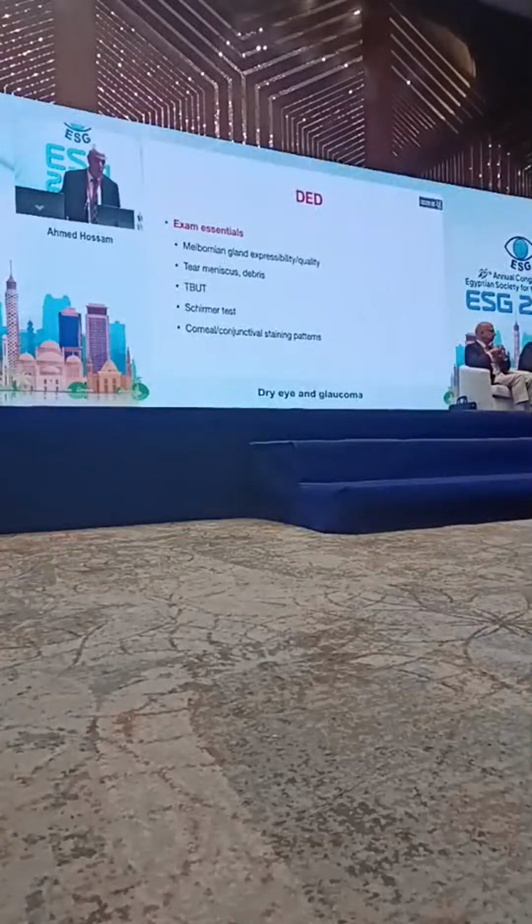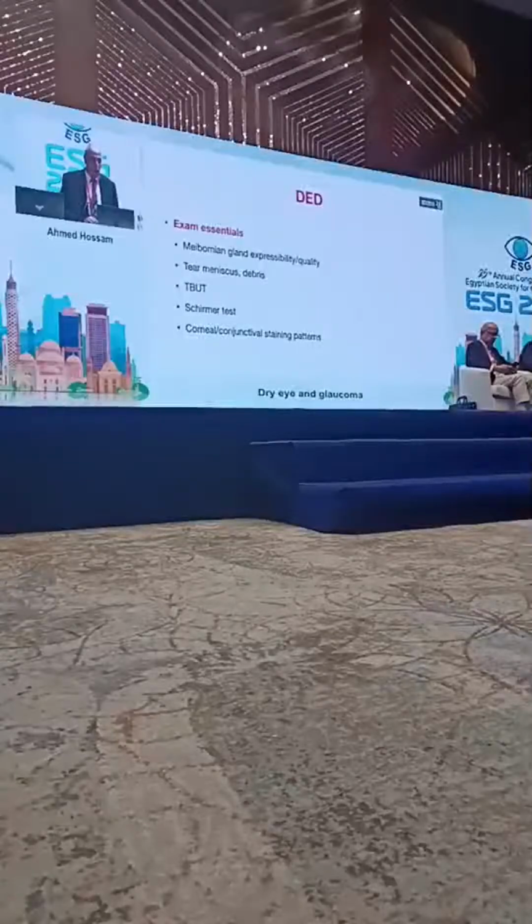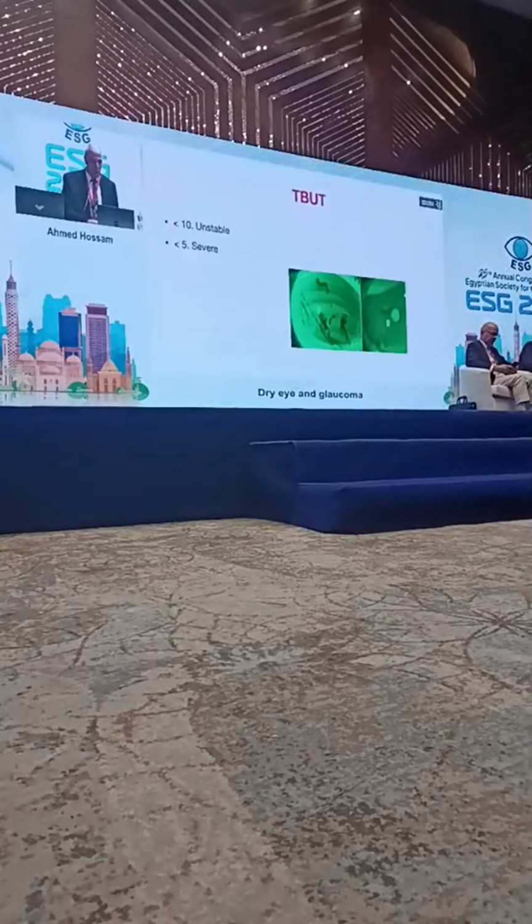How to examine the patient with dry eye disease? First, we look for meibomian gland expressibility. We look for the tear meniscus, and the presence or absence of debris. We test for tear breakup time. We use fluorescein, and lastly, we look for conjunctival and corneal staining patterns.